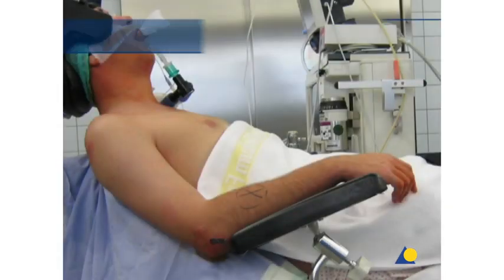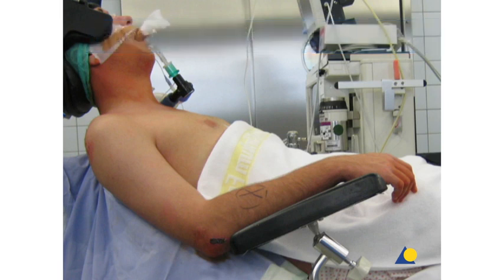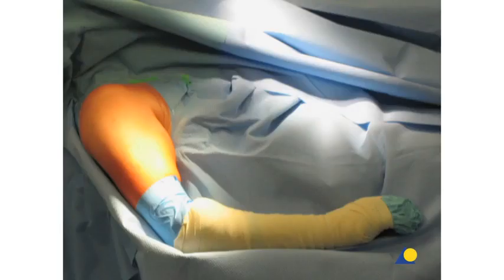The patient is placed in the beach chair position. Care is taken to position the neck correctly. A proper position of the cervical spine in all planes should be provided. Excessive extension of the neck is avoided. The support plate under the treated shoulder is removed. On the injured side, the draping of the arm should allow free movement of the shoulder.